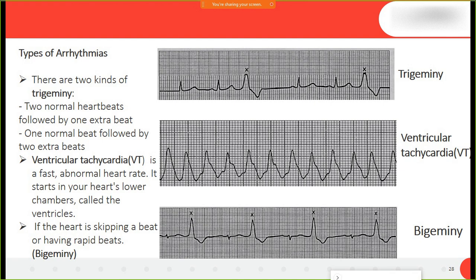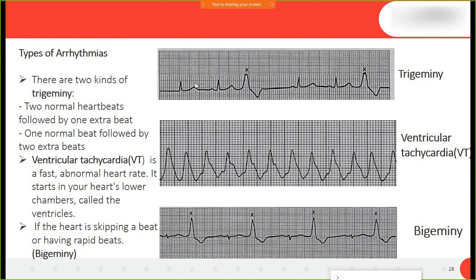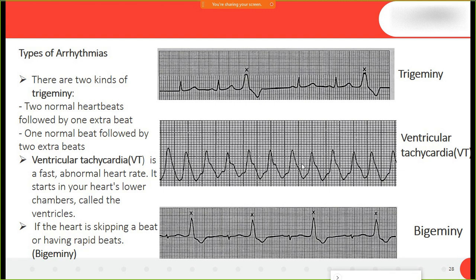There are types of arrhythmia we are going to predict using machine learning. First is trigeminy: two normal heartbeats followed by one extra, or vice versa — one normal and two extra beats. Second is ventricular tachycardia, which is abnormal fast heartbeats starting in the heart's lower chambers called the ventricles.